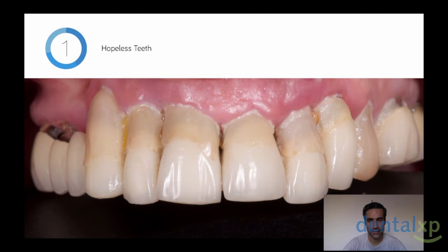Here is a lady who is 55 years old, and the periodontal status is really bad. She has mobility type 3 in all the teeth, except some molars, but as you can see, she has now decided to remove all her teeth because she really doesn't like what she has in her mouth. She doesn't like her teeth. The other thing she asked me is that she doesn't want to wear a removable prosthesis in any case. So I have to place immediate implants and do an immediate loading.